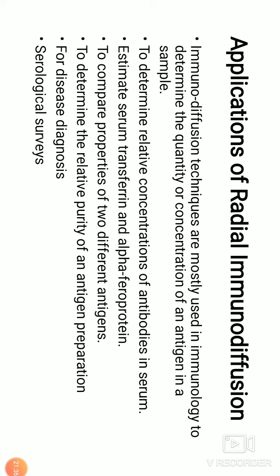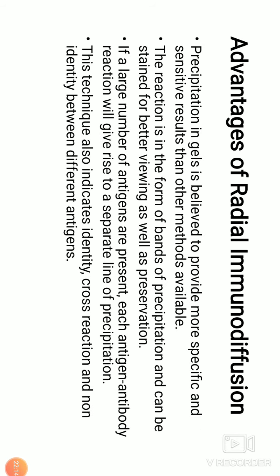Application. It's an immunodiffusion technique mostly used in immunology to determine the quantity or concentration of an antigen in a sample. This is also used to determine the relative concentration of antibodies in serum, estimate serum transferrin and alpha-fetoprotein, to compare properties of two different antigens, to determine the relative purity of antigen preparations, for disease diagnosis, serological surveys, etc. There are various applications.